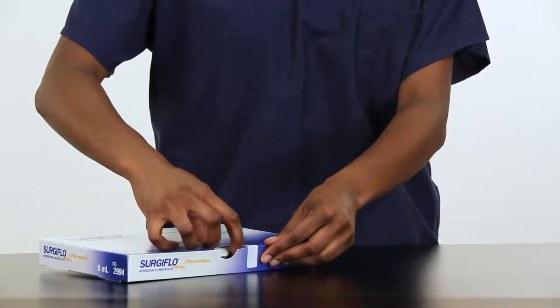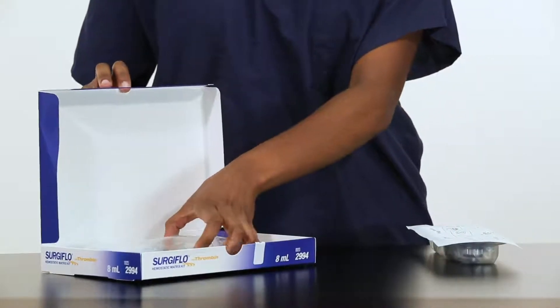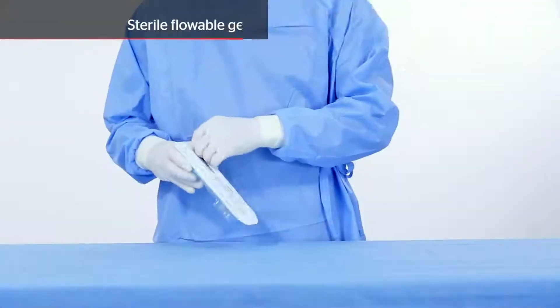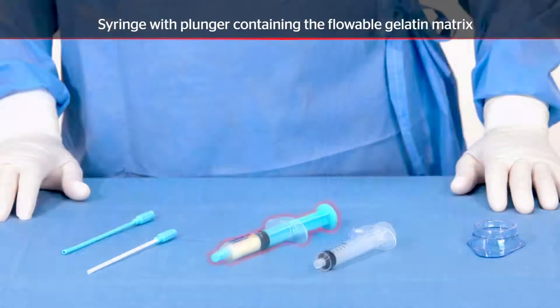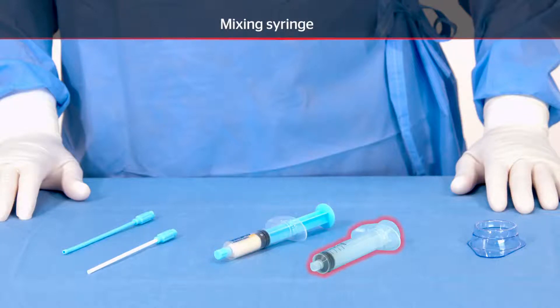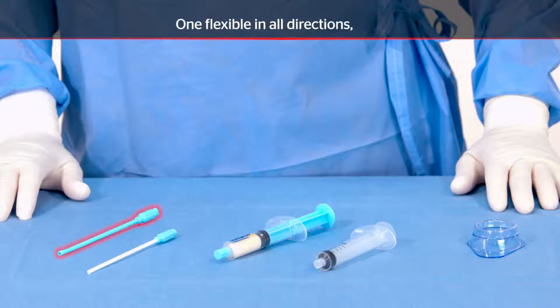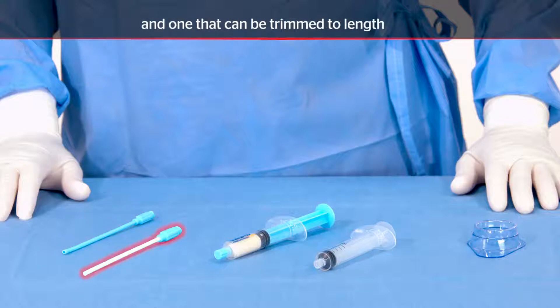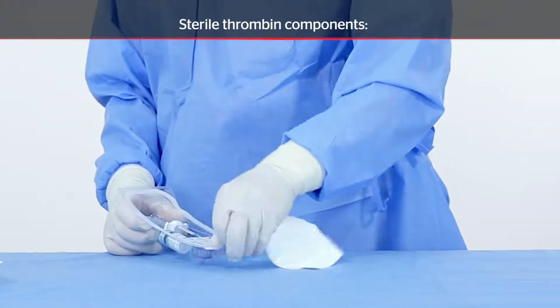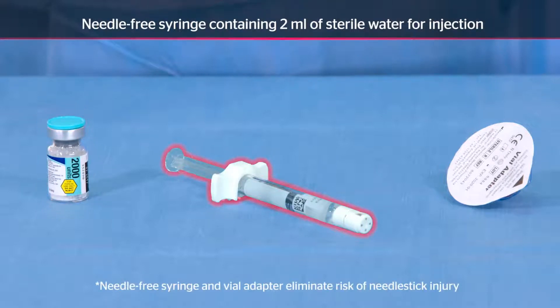The Surgiflo hemostatic matrix kit with thrombin consists of two components: lyophilized human thrombin and the flowable gelatin matrix. The flowable gelatin matrix components include a sterile syringe with a blue plunger containing the flowable gelatin matrix, a sterile empty mixing syringe, a sterile liquid transfer cup, and two sterile applicator tips — one flexible in all directions and one that can be trimmed to length. The sterile thrombin components include a thrombin vial containing 2,000 international units of sterile lyophilized human thrombin and a needle-free syringe containing two milliliters of sterile water for injection, plus a sterile vial adapter.